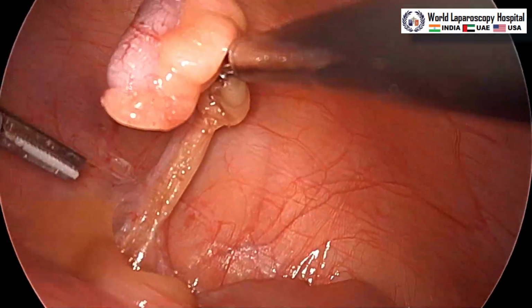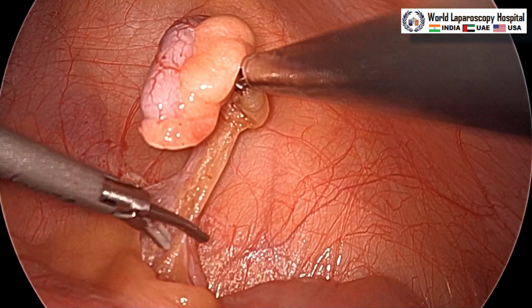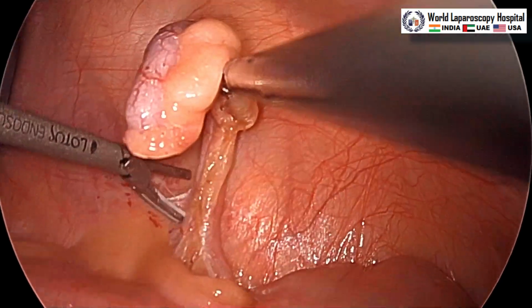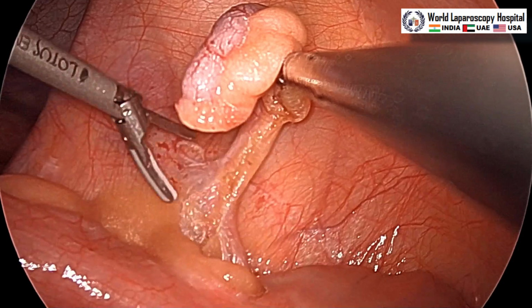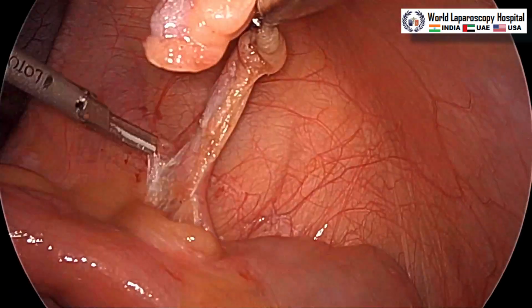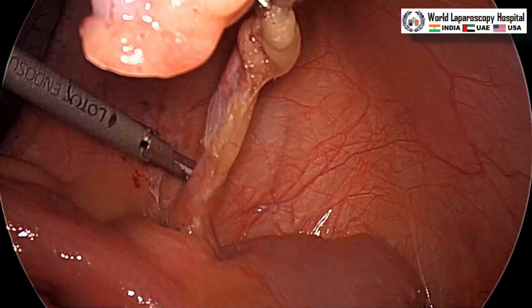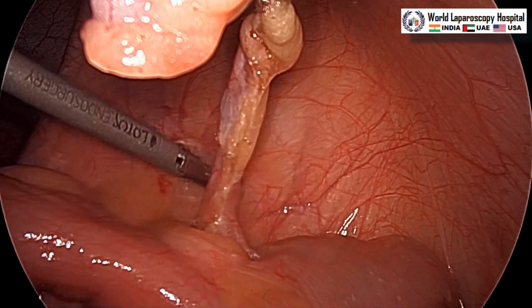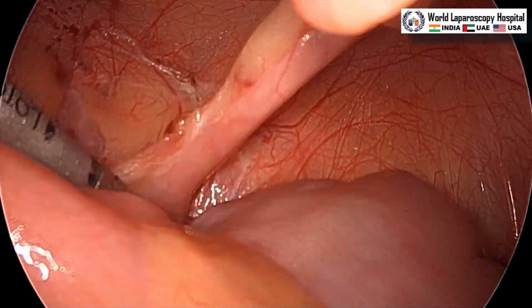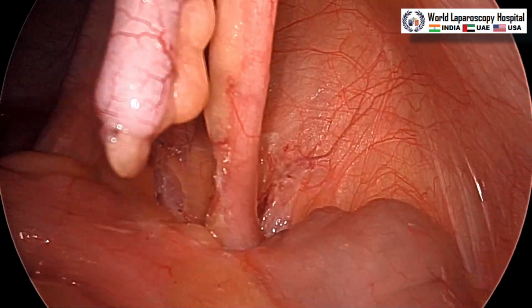Right now the telescope is in the epigastric port, and the light cable should be at 9 o'clock position, so that you can see laterally, and then the vision behind the appendix will be clear. So, this lateral mobilization is performed, and after that we will tie the knot. Here we are using the extracorporeal Mishra's knot.